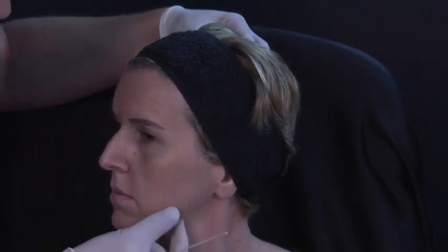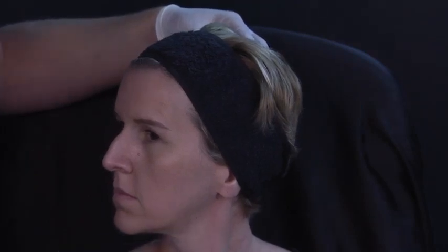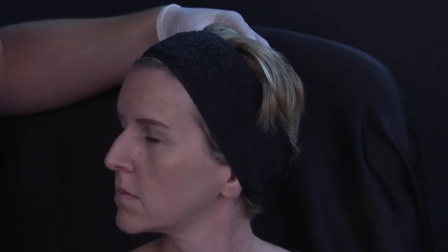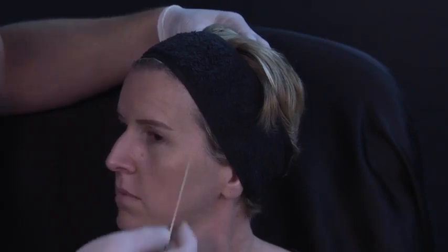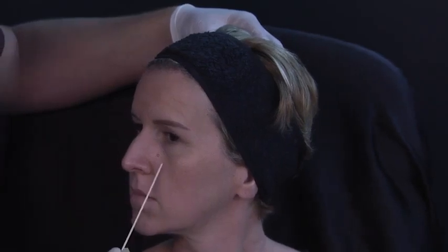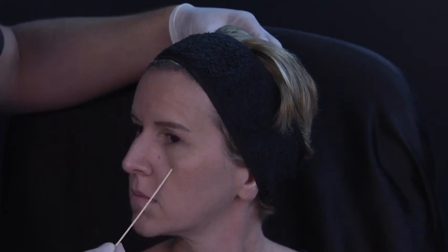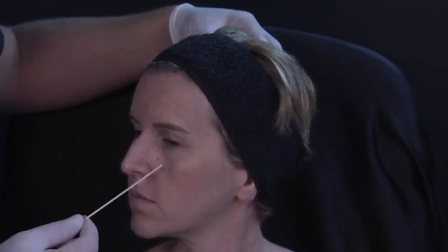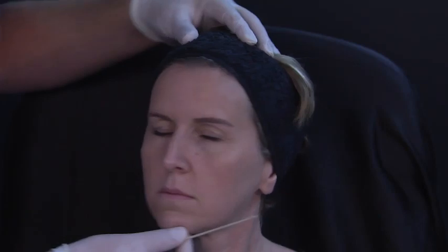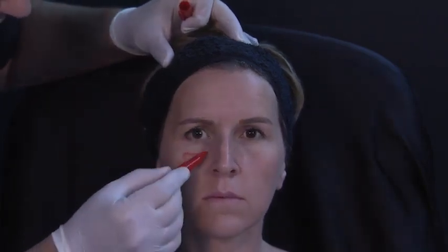She has very little saggy skin here. So the priority in this case, as I was doing before when I asked you the question: does she need a lot of lifting? No. Does she need volume here? Yes. So my first choice is to treat her in the midface with volume. Now we're going to start because she needs volume. This is the area where the bone structure is visible, and this is the malar area that really needs volume.